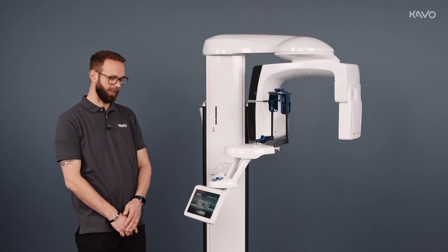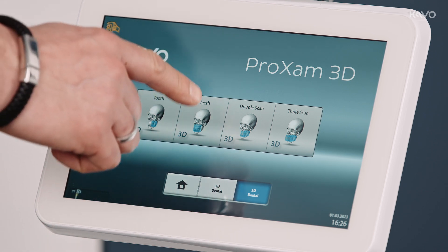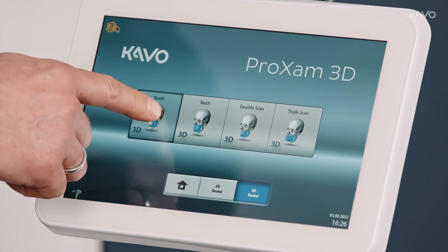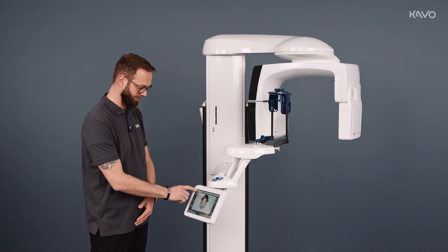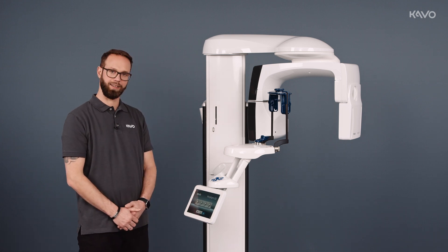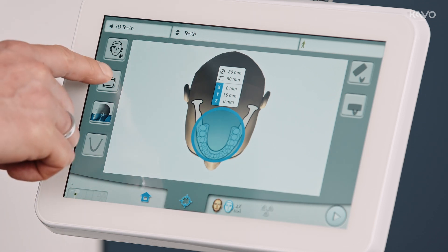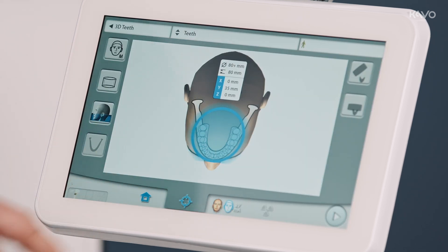On our display, we go to the 3D button and can now see all the 3D programs available. We have tooth, teeth, double scan and triple scan. Tooth is our small volume option for 5x5 or 5x8 — the 8 corresponds to the height. For teeth, the volumes are 8x8 and 10x8. Our Pro-XM3D also has this as its maximum volume, in which case it changes to 10x8.